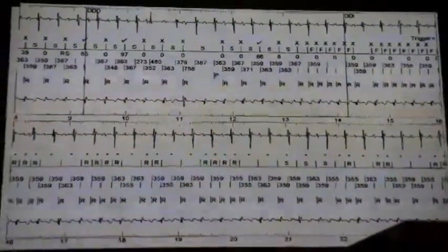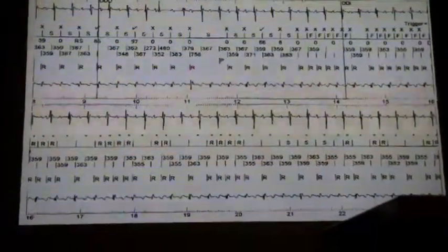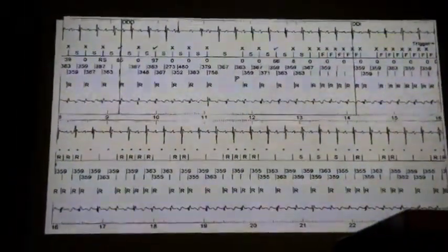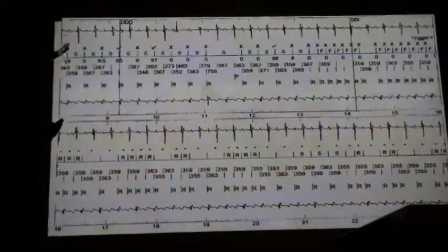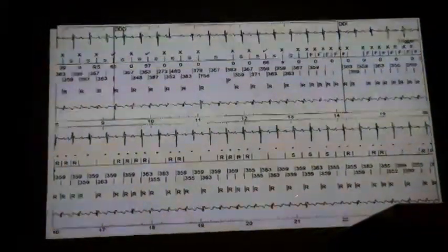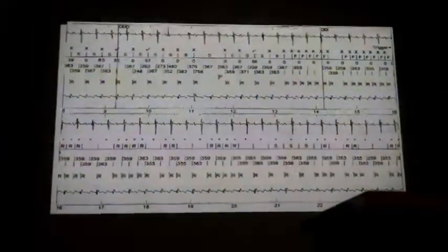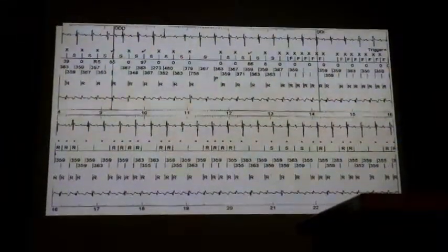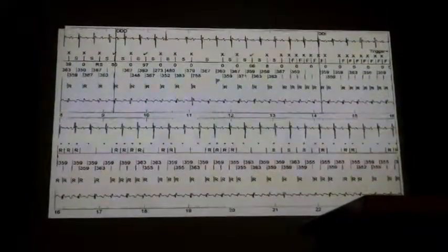His R wave in this episode was about 2. I showed his R wave was 4, but when he was doing this, it was 2. We measured this signal here, and it was 2 millivolts. So let's elaborate just on the markers, the ones with the S. This is the classification.